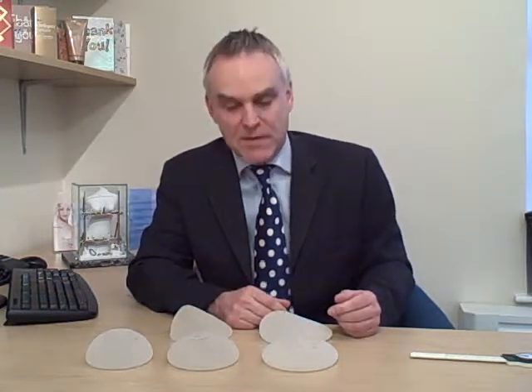So 20 years ago when I started doing breast implantation, there were really only 3 or 4 types of implants. Now there's over 250 sizes, different heights, different base widths, different shapes. So I'm going to talk a little bit about how you choose what's best for you.